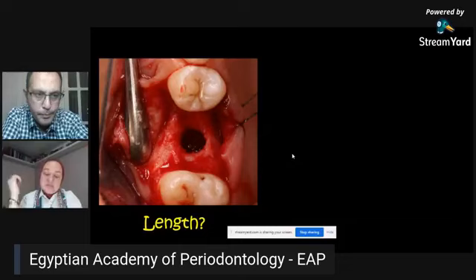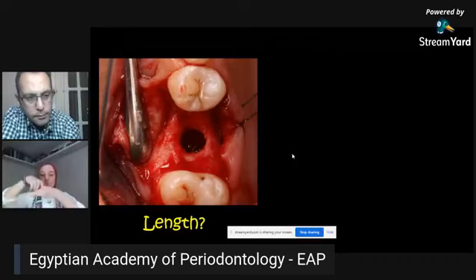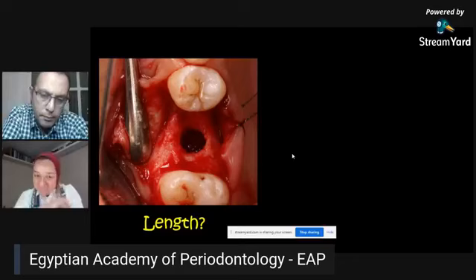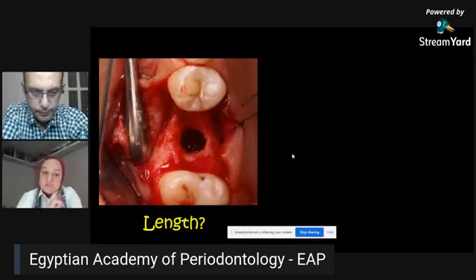And sometimes, even if it's your first case, we put the stopper of the file with the drill so that it doesn't slip. Once the stopper touches the crest of the bone, you just go out. So if it's your first case, you have to be very careful, and you have to leave a minimum of 2 millimeters safety margin between your drill and the sinus floor. So if you are talking about 9 millimeters here, you're going to drill 7 millimeters length.